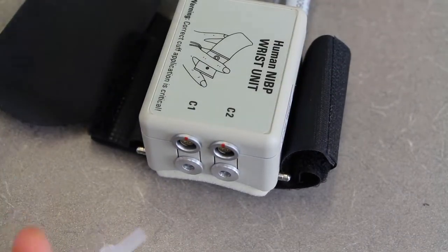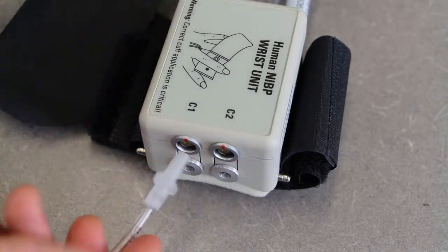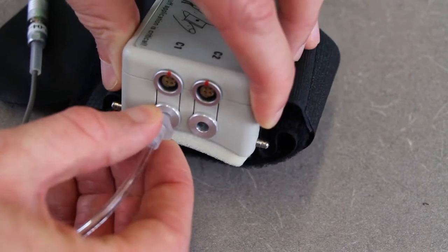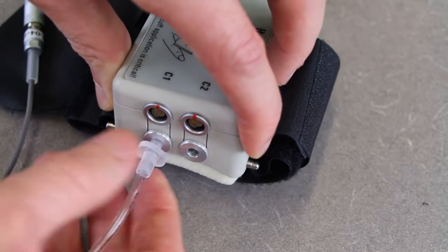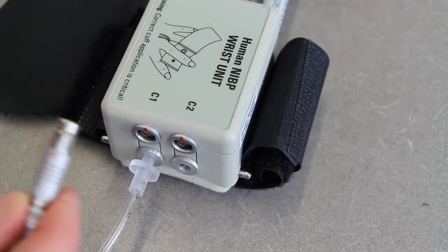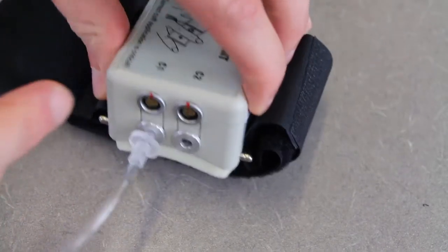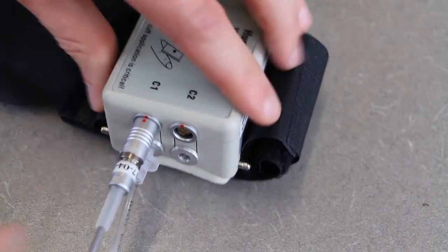Take the two tubes from the finger cuff — the air tube goes into the bottom hole, put it in lightly finger-tight, and give it a little twist to create some friction. For the data connector, line up the red dot on the connector with the red dot on the port and push it in until it clicks.